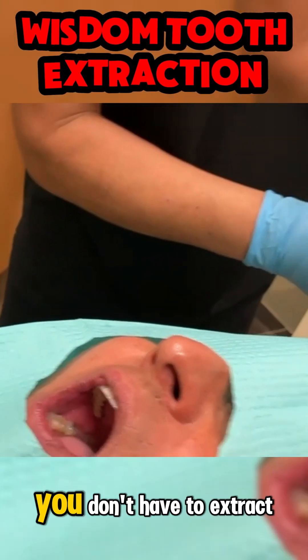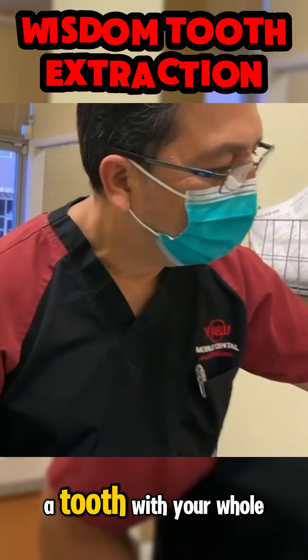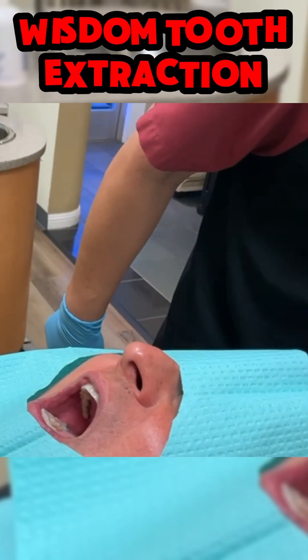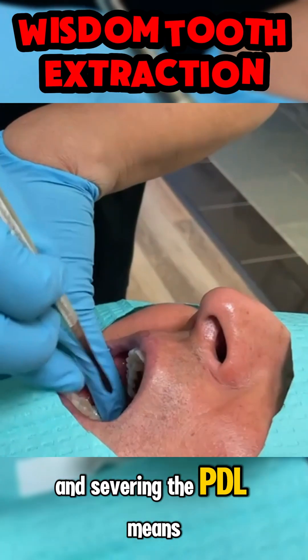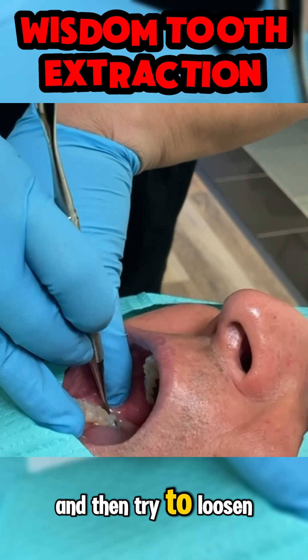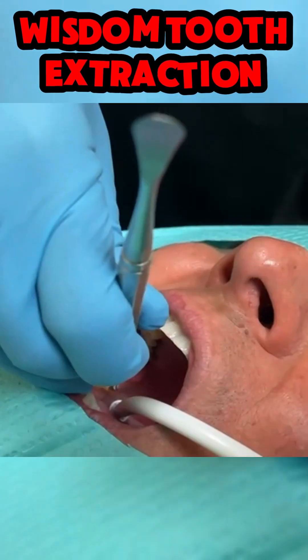But when we're doing something like this, you don't have to extract a tooth with your whole jaw numbed. After you've numbed up the tooth, we are going to go ahead and sever the PDL. Severing the PDL means that you're going to go here and then try to loosen up the tooth by severing the PDL right here.